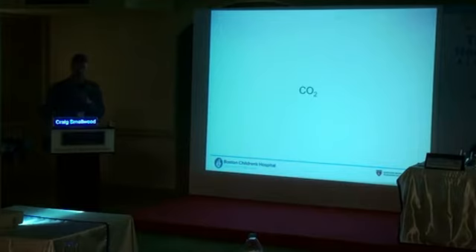But CO2. So one of my mentors in critical care, he's the chief of the clinical department. He doesn't do so much research, but he says, Craig, if you only had one monitor, what would it be? And most people, I think, would choose probably SpO2. Oxygenation is probably the most important, maybe blood pressure. You think about vital signs. And he says, honestly, if I had to choose one monitor on any critically ill child or infant, I would choose end-tidal CO2 because it can tell you so much about your patient that is more difficult to detect than oxygenation.